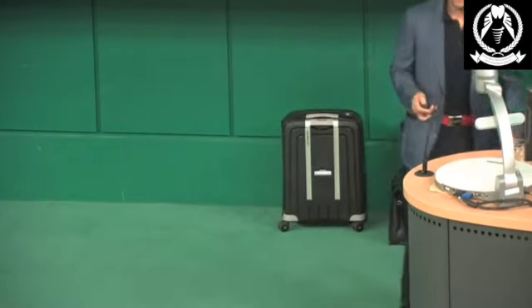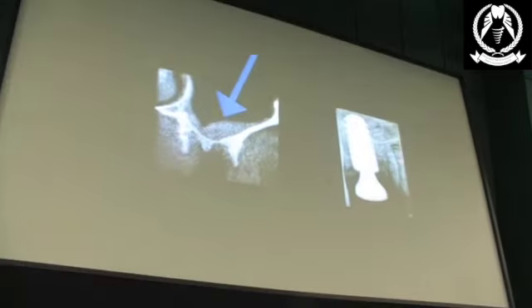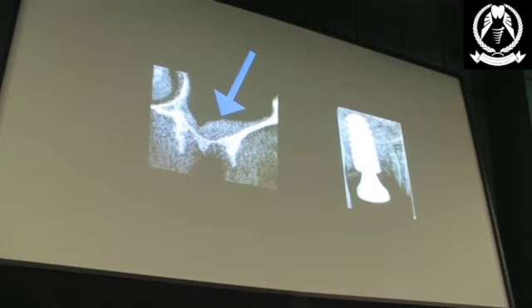We sometimes meet challenges in implant dentistry. For example, here we've taken an upper 6 out, and we have very, very little bone. We have a sinus that comes in the way. But again, using techniques of immediate placement and very conservative sinus lifting from the crestal region, that's from the socket space, we're not traumatizing our patients. We're able to place and stabilize an implant at the same time as extraction, even at this level of bone.